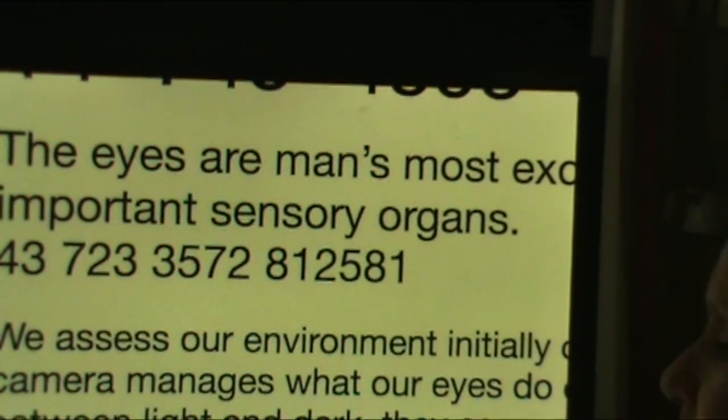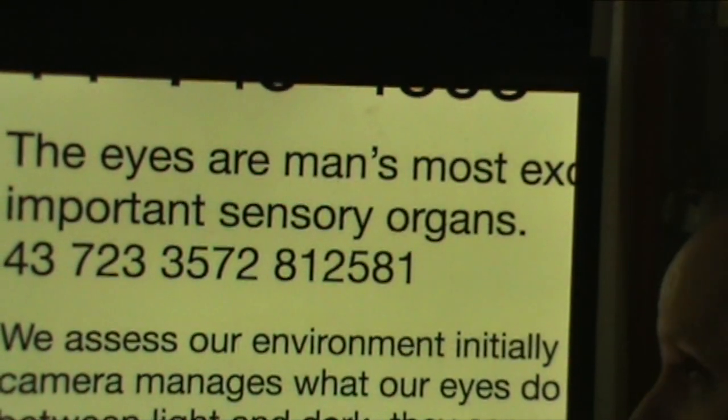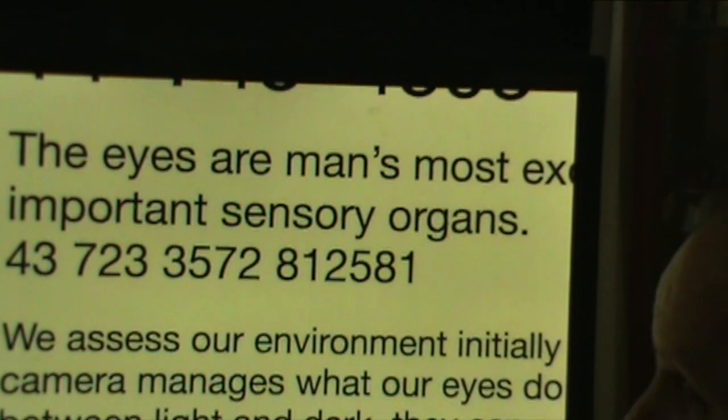We're going to go ahead and show that this system has the capability of showing it in the natural mode, which is, of course, what you see is what you get, essentially, whether it's a color print or black and white print or gray print or whatever it is, it's going to demonstrate that for you in this mode.